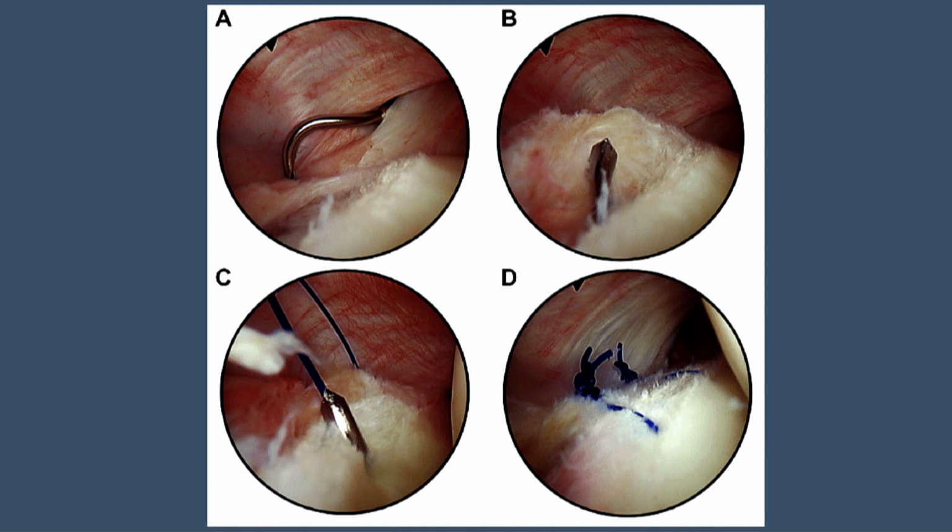And in a chronic scenario, or when the patient comes for a revision surgery, most of the time this has not been repaired, and that can be the cause of failure of the ACL. And there are 2-3 ways. Either if it is possible, you can lift up the capsule and put all inside devices from inside the joint, or if it is not possible, some people say this is shoulder in the knee joint, because this is kind of shoulder surgery inside the posteromedial.